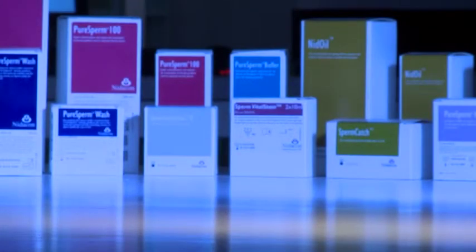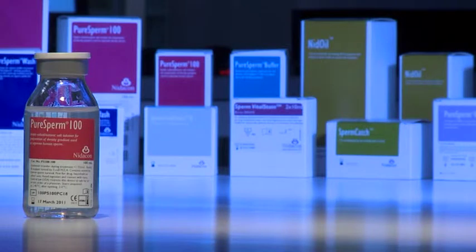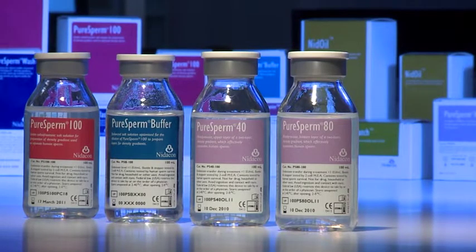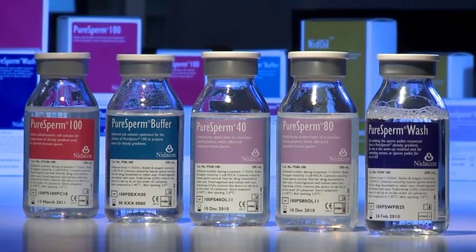To prepare a gradient, you need PureSperm 100 and PureSperm Buffer to dilute to your desired concentrations. We recommend 40% and 80%, or use the ready-to-use PureSperm 40 and 80. After the gradient preparation, PureSperm Wash will be needed.